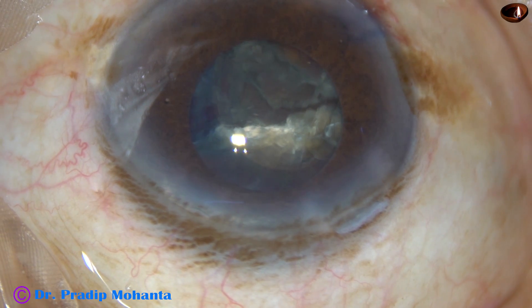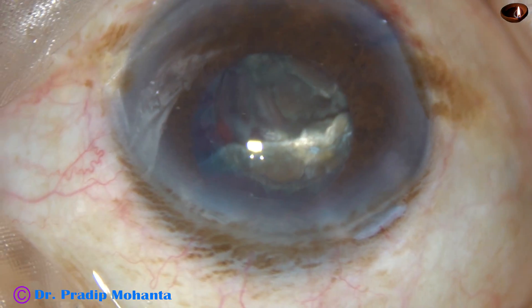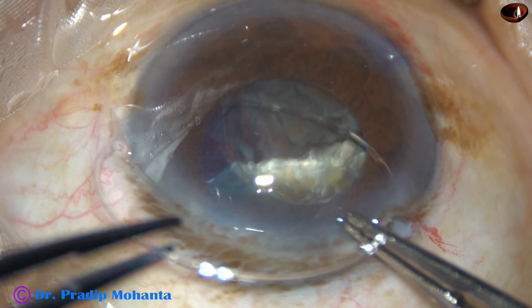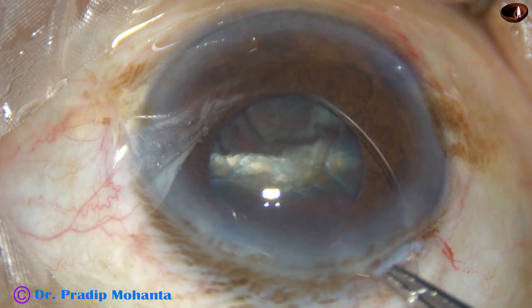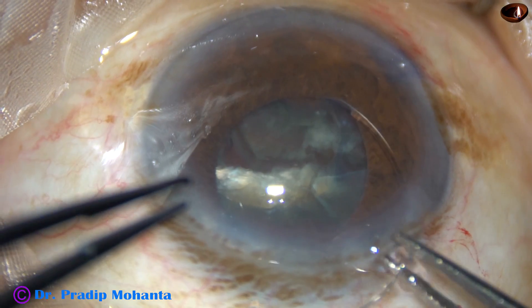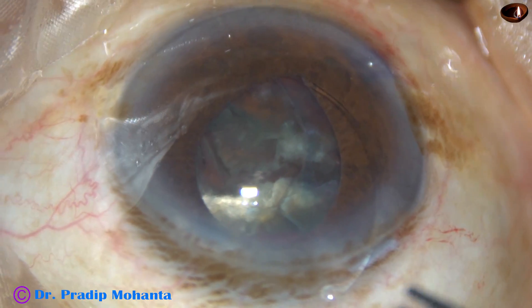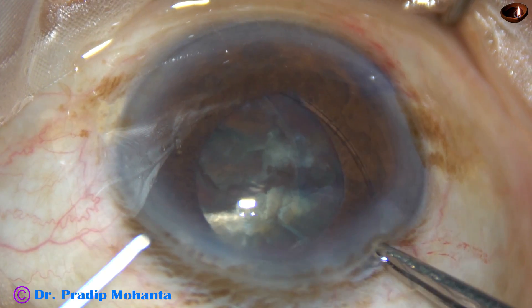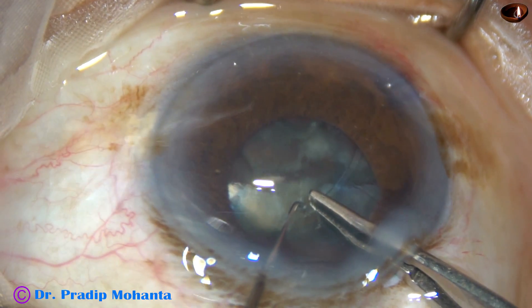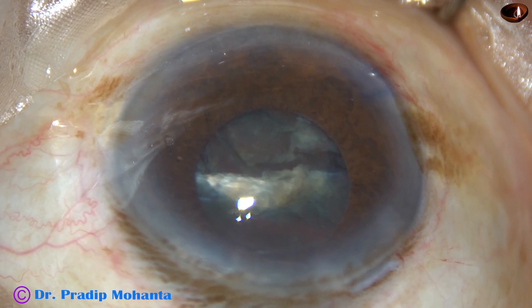I inject some visco — 2% hydroxypropyl methylcellulose — and take a CTR. The leading end goes into the capsular bag and I very gently advance the CTR. Coming near the trailing end, I hold it with McPherson's forceps and introduce a Sinskey hook through the side port. With the help of the Sinskey hook I place the CTR fully into the capsular bag. Now the bag is supported.